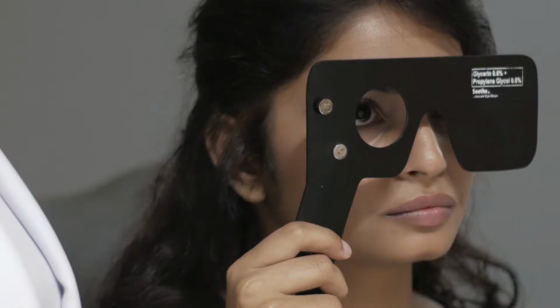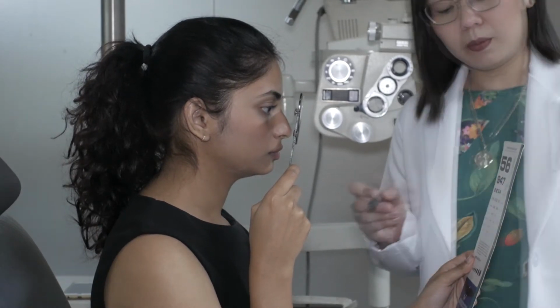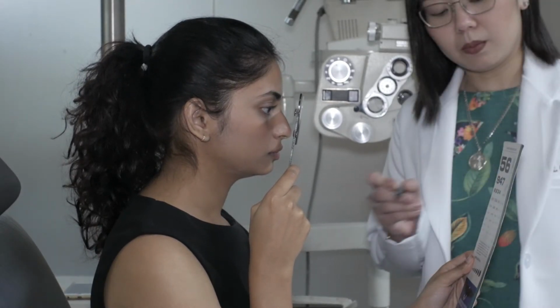Test one eye at a time and cover the other eye. Let us begin with the right eye. Test with the pocket chart at a distance of 14 inches or 35 centimeters. Use reading glasses if the patient is presbyopic, usually greater than or equal to 40 years old. When recording the results, use Jaeger notation. Now repeat with the left eye.